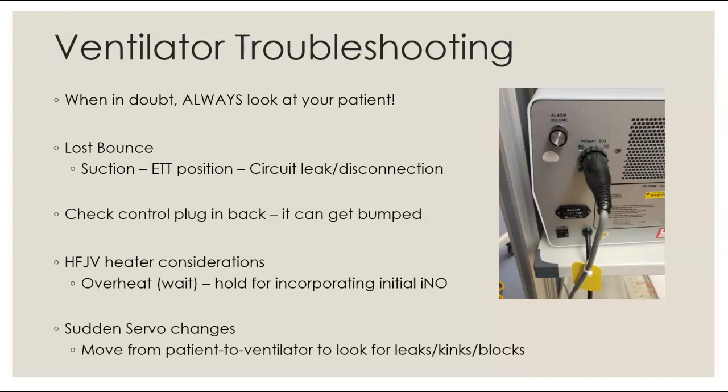Along with that, if you apply surfactant while a baby is on a jet, you can give surf with the high frequency oscillatory ventilator because it will push it in. The jet will pull the surf out. So if you are surfing a baby and then putting them back on the jet ventilator, make sure you instill it with the Neopuff and it is well distributed into the lungs before you put it on the jet. Keep that in mind.